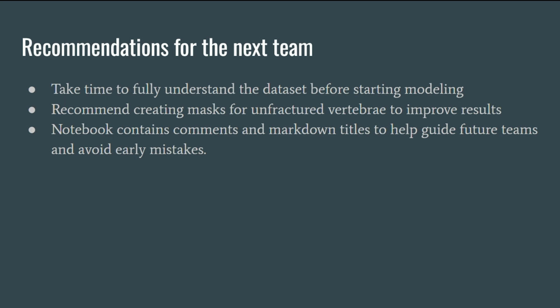For the next team, we recommend taking the time to fully understand the data before diving into the modeling. We spent a lot of time figuring out the cervical spine fracture dataset and how it was structured, including differences between NIfTI, DICOM, and CSV files.